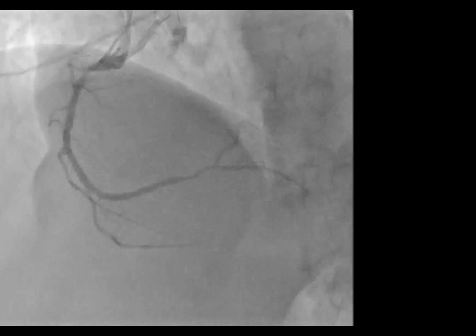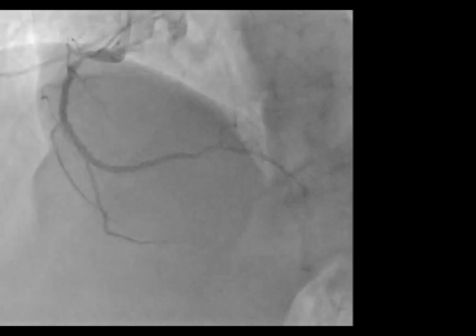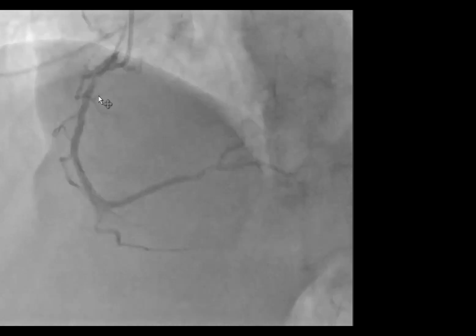As you can see here, this is the first shot of the contralateral side. I usually do the contralateral side shot first to understand the anatomy. As you can see, there's an obstructive at least 70-80% lesion in the proximal portion of the RCA.